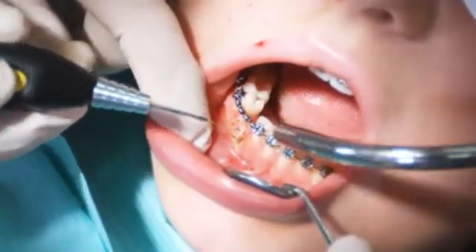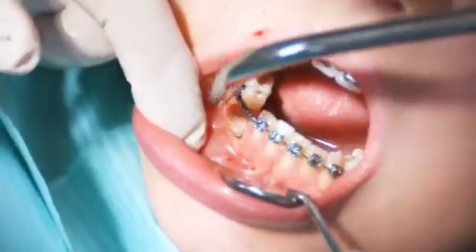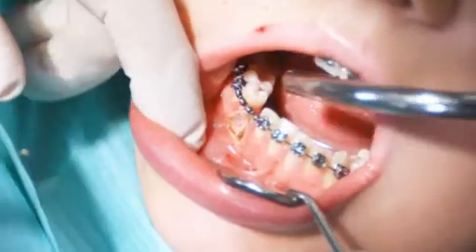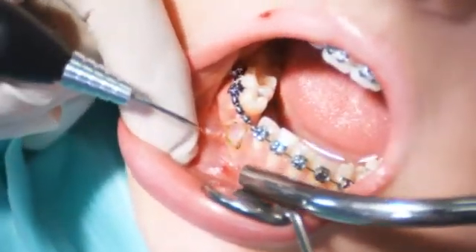When cutting through soft tissue, proteins may accumulate on the tip of the fibre, causing it to carbonise. If this happens, remove the carbonisation residue from the fibre tip or shorten the fibre.